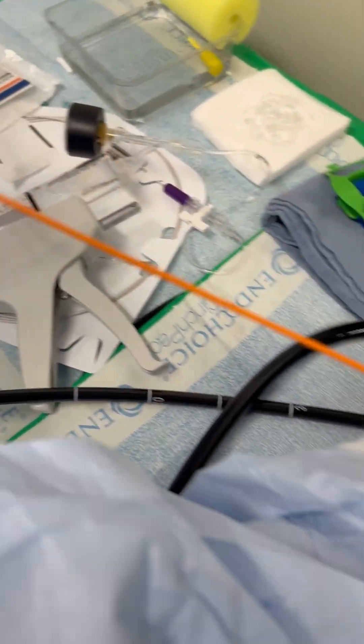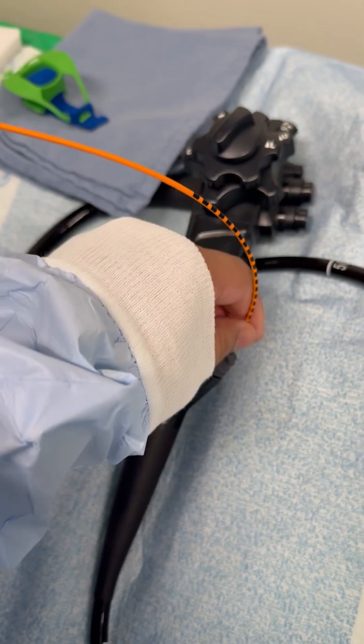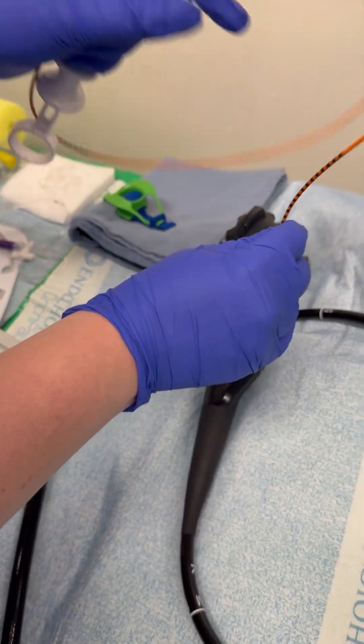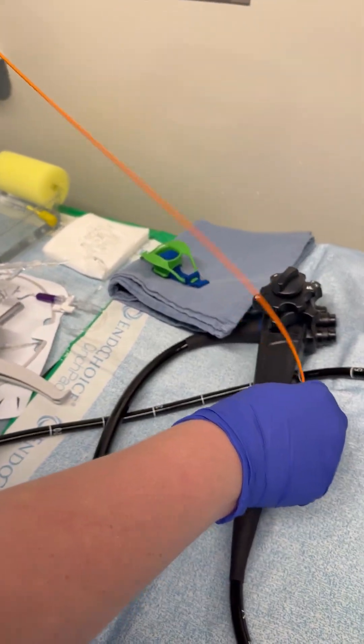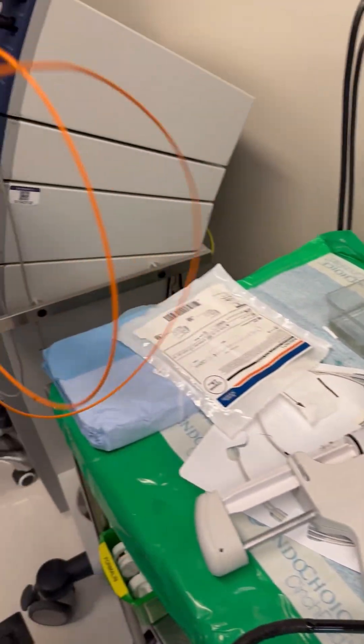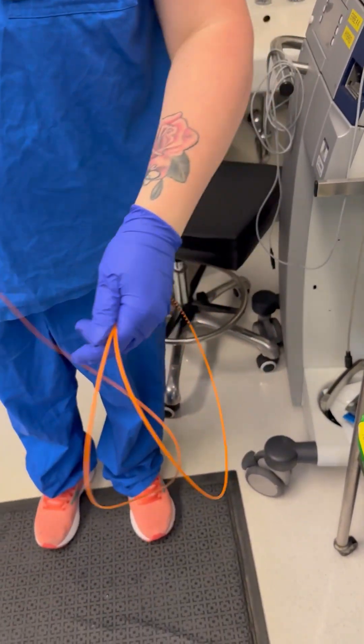It's pretty safe. No major issues with this. Should you show us the technique of taking it out so we don't spill body secretions on people around us? Excellent. Alright.